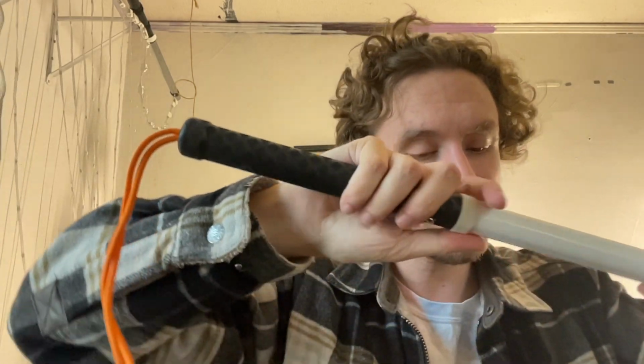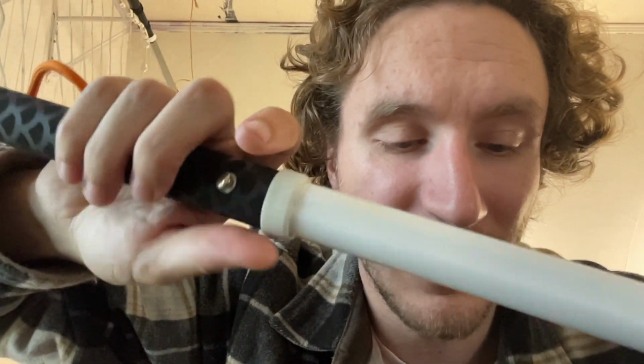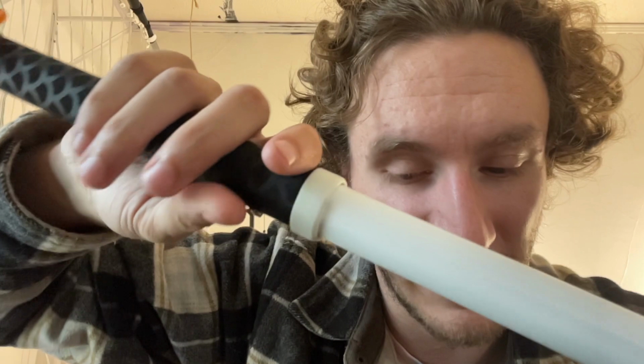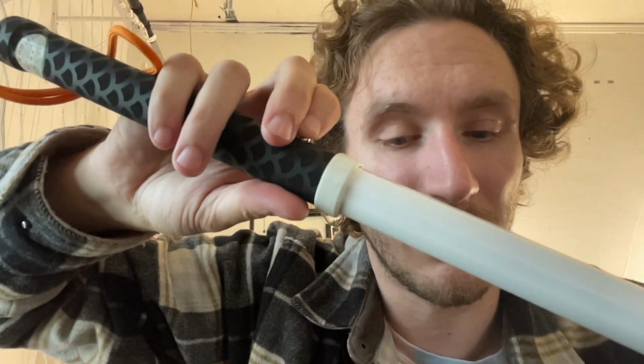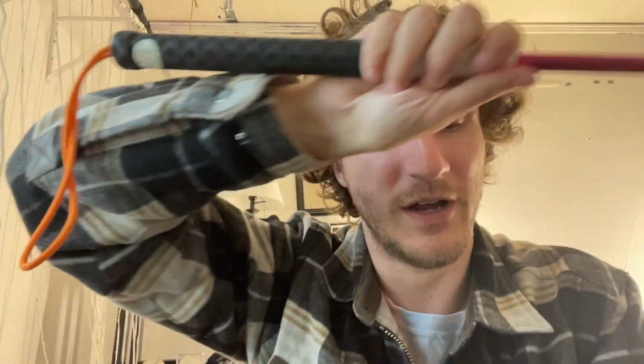So, each section of this cane is similarly shaped to the grip in that you have these four squared-off bits that create almost a, my fiance said it really well. She said it looks like a pencil. And so it is almost a pencil-shaped cane, which is kind of cool. So all of the other sections are white, except for our last two. And specifically, they are this really cool colored, like a reflective red-pink material, which is really interesting to me. And I've never seen another cane like that before.